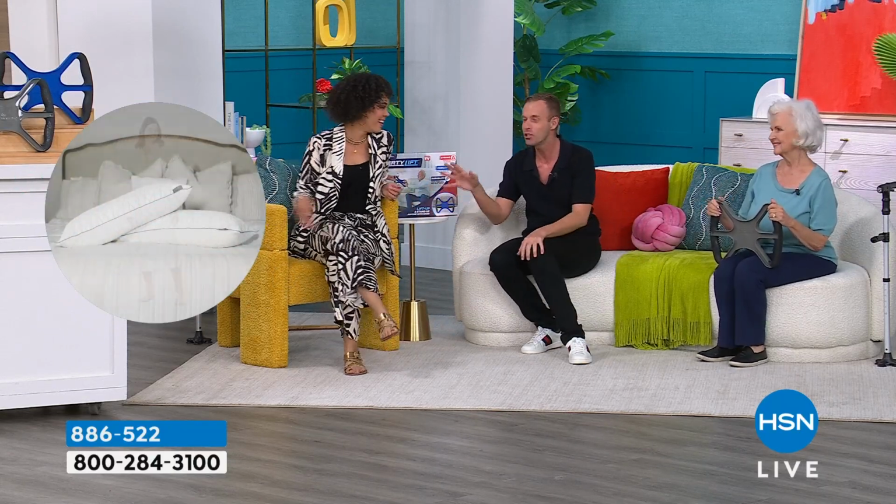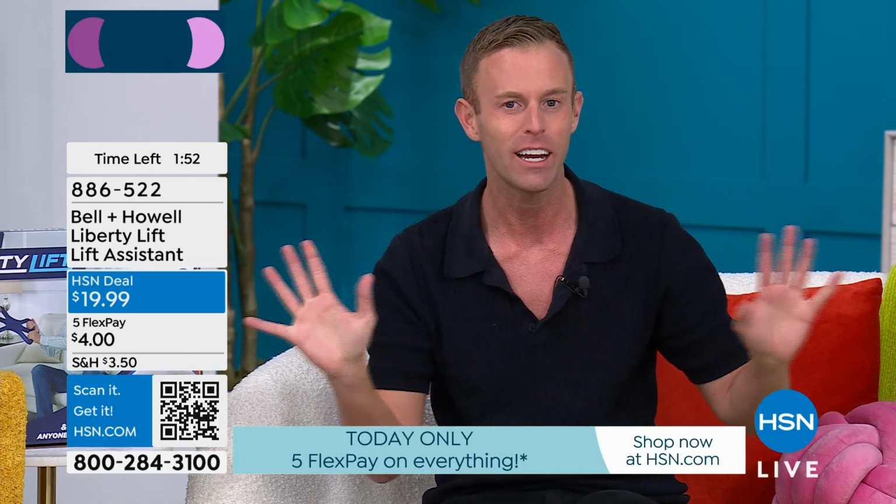It is a two-person job, okay? You can't use this by yourself. You need to have somebody there to use it with you. When you're doing that, just have it in a place where you have access to it. If you always go to grandma's house or mom's house or the aunt's house, and they always ask you to help them off the couch, or they always visit your house, have it for them, have one in the car. There's always a case to be made to have 2 or 3 of these in different areas of the home.